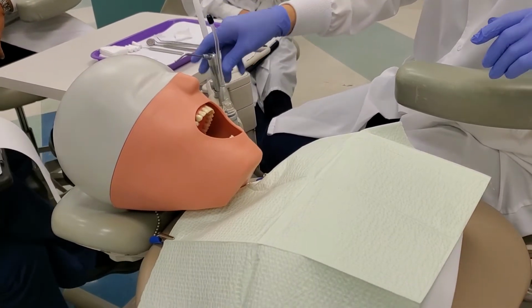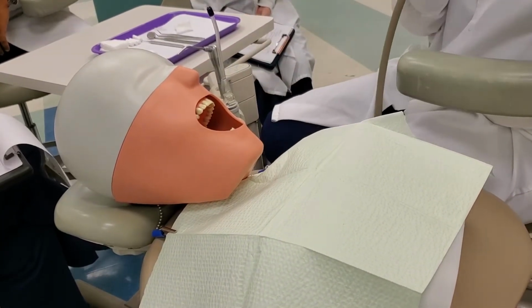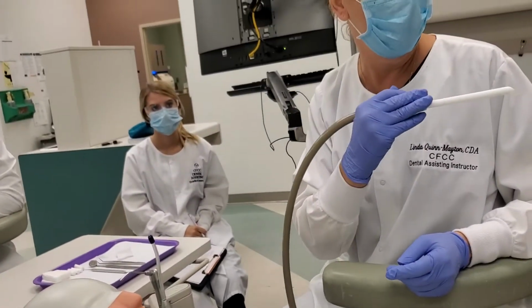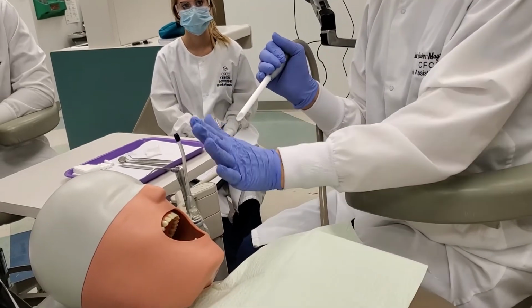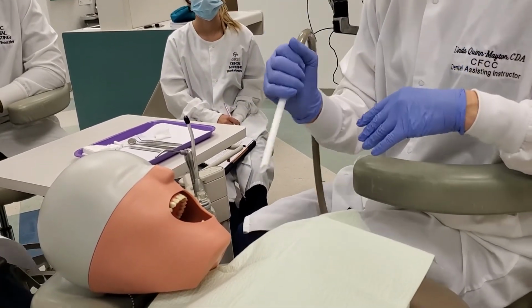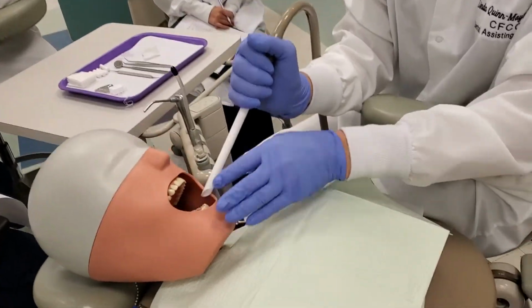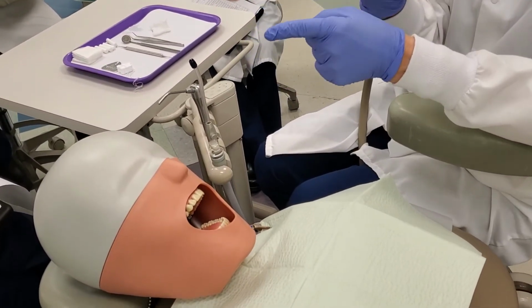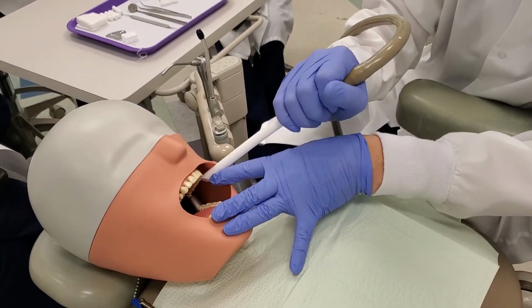So, the perfect position for the HVE is one tooth posterior of the tooth you're working on, because gravity is going to be forcing that water back to the patient's back of the throat. So you always want to be behind the tooth that the doctor is working on, parallel, so the beveled edge is going to be parallel to the tooth. Here, I use the tooth up on top. So it's going to be parallel to the tooth.